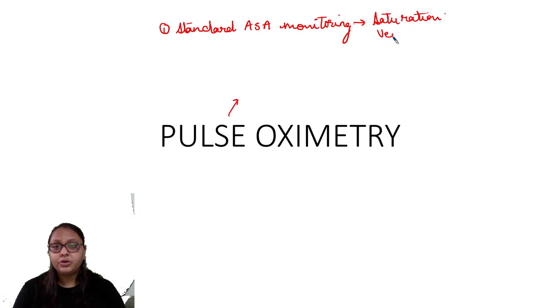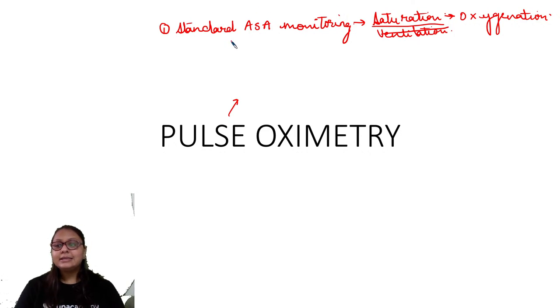It will tell us about the ventilation, and it will tell us about the saturation if the patient is oxygenating. It will tell us about the oxygenation. So that is very important. It is a standard ASA monitoring device.